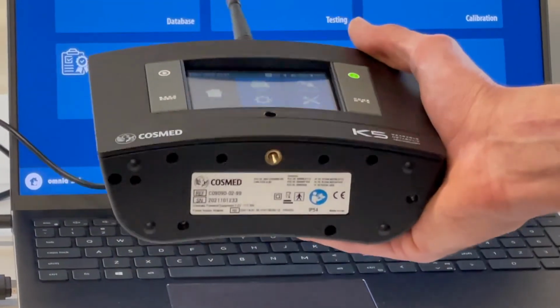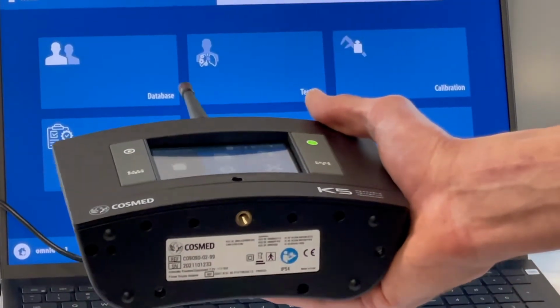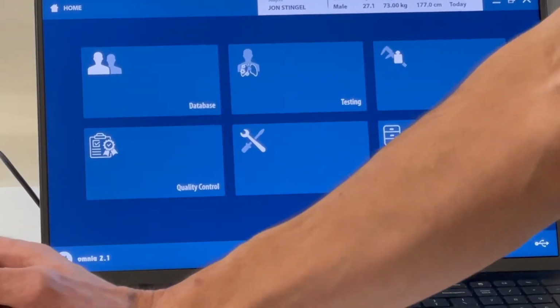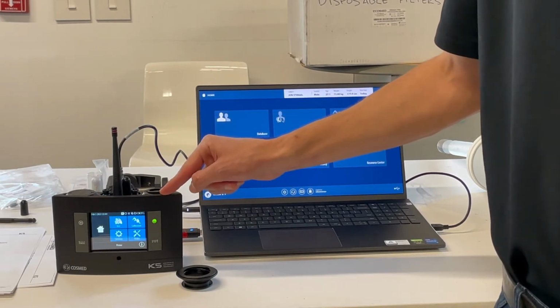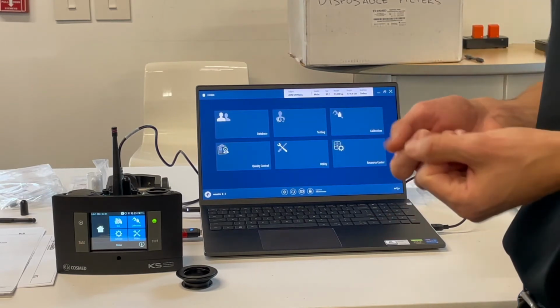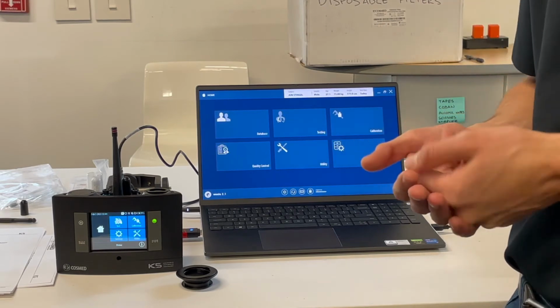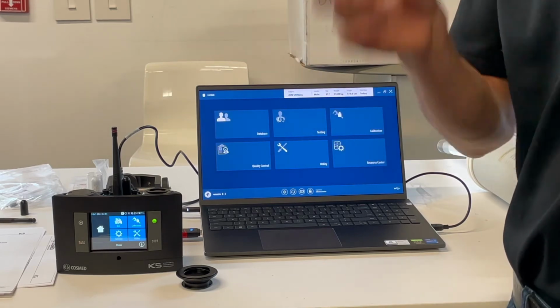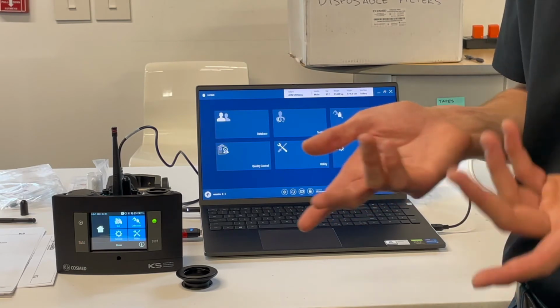We already imported the test over here and exported our Excel file, so we don't need to worry about it being stored here anymore. It's gone. So, like I said before, if we ran a test through the K5 again, we're not going to be able to pull up his subject card. We'd have to re-enter it. That's why you have to be careful with entering it appropriately, so that when you go to import, it recognizes it's a dupe and sticks them together instead of creating two separate subject cards. Otherwise you're finding the discrepancy, exporting one test and re-importing it, and it's a waste of time.